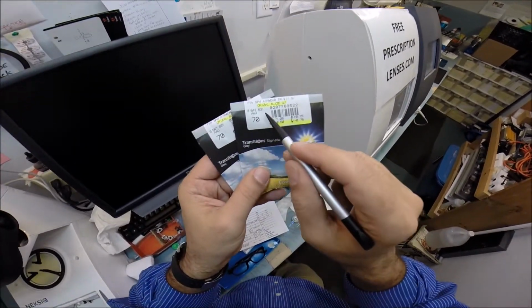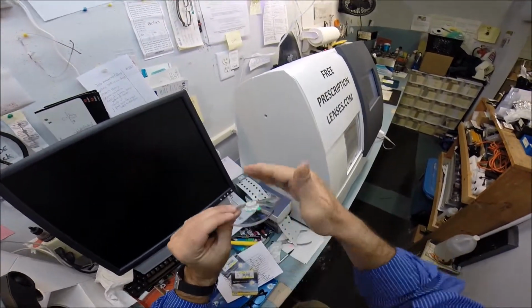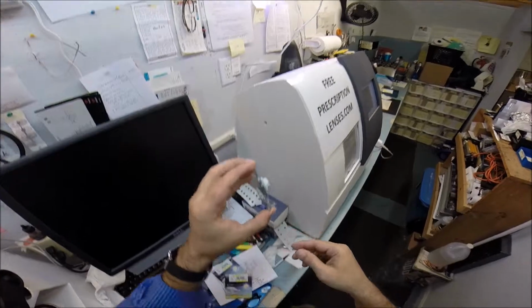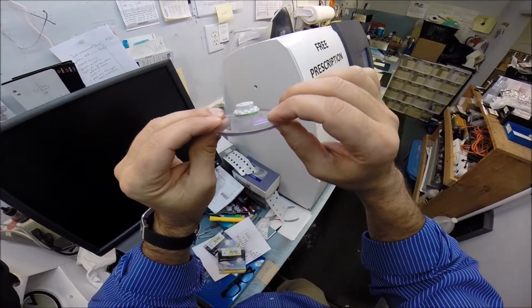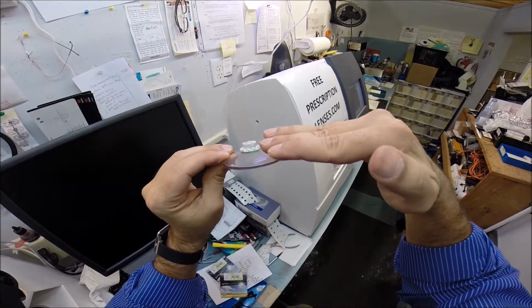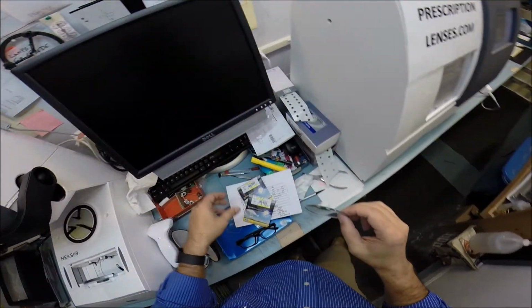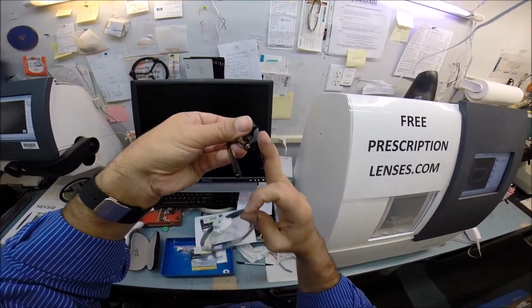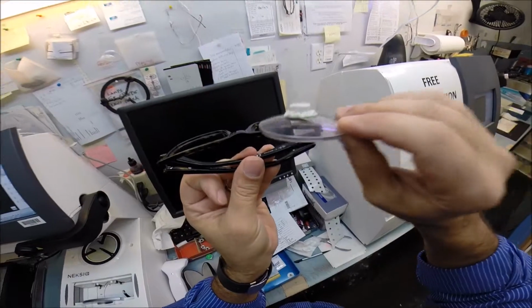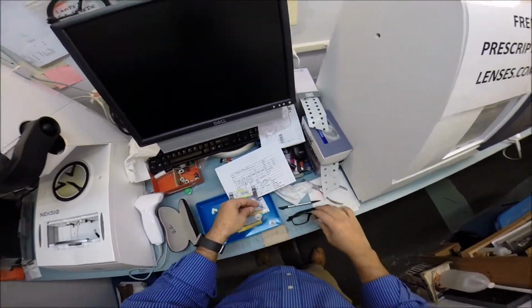Also, your lenses are aspheric, meaning that a spherical lens is completely round like a fishbowl. This is aspheric, where it flattens the curvature. Not only is it 40% thinner and lighter than plastic, but the curvature of the lens is not rounded. It's very flat. So not only will it fit into the frame, it's going to be very flat, following the contour of the frame, so that it does not bulge out and give you an ugly cosmetic appearance.